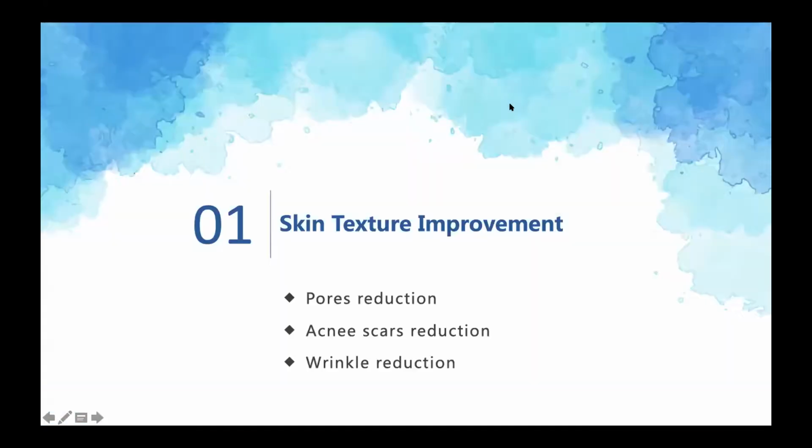I have good results with this kind of laser, which is a non-ablative fractional laser. So we have almost no downtime, so it's quite good for patient. And about the results, we have good results on the skin texture, because it can do a better result on pore reduction, acne scar reduction, and wrinkle reduction.